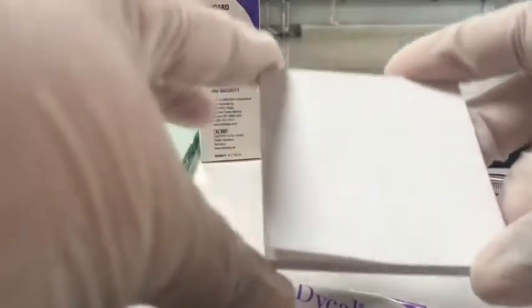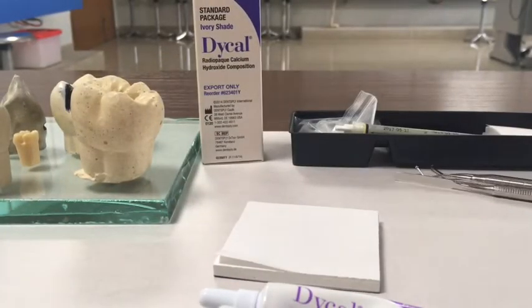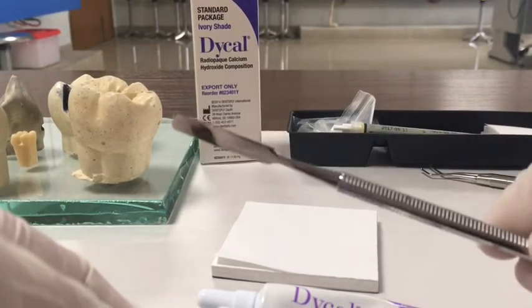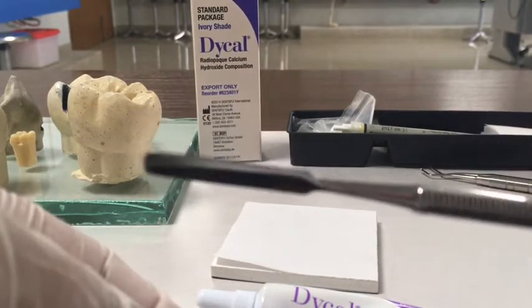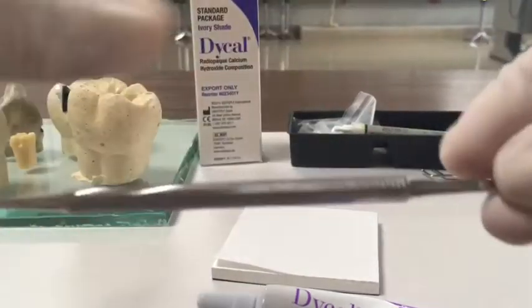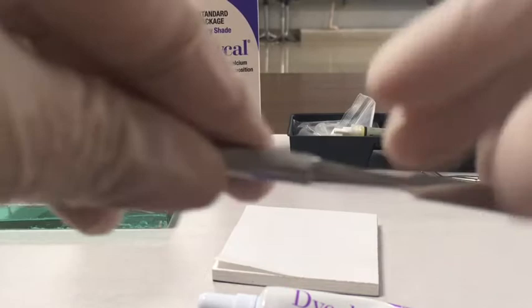So this is the mixing pad which we are going to use for mixing our base and catalyst together. And then we have the cement spatula, which is used for generally mixing all kinds of cements in dentistry. We are also going to use it for mixing calcium hydroxide cement. You see it has a long flat blade on either side, which is ideal for mixing cements.